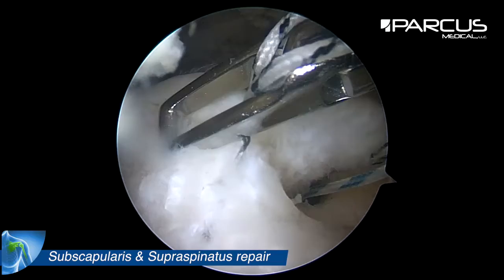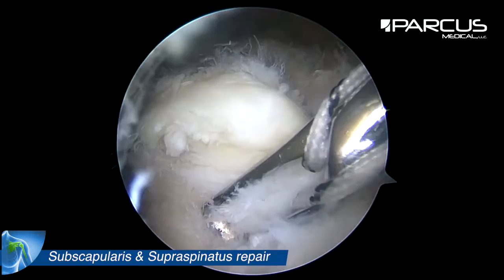We check the reduction, but we won't tighten the knot right now because otherwise it's too difficult to continue the repair.